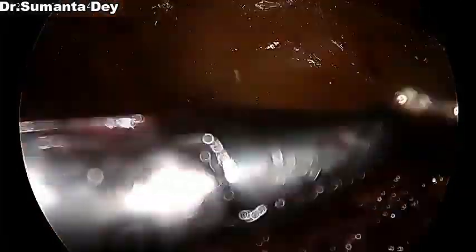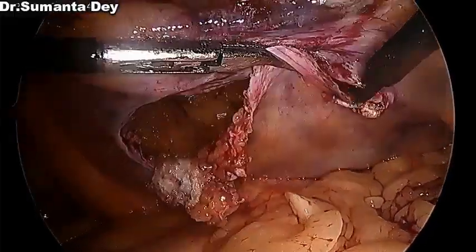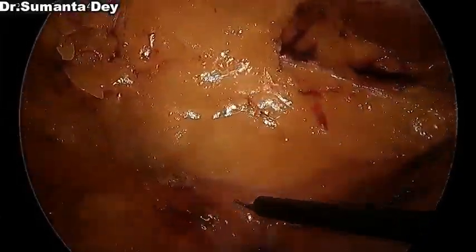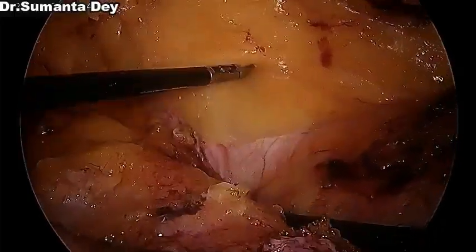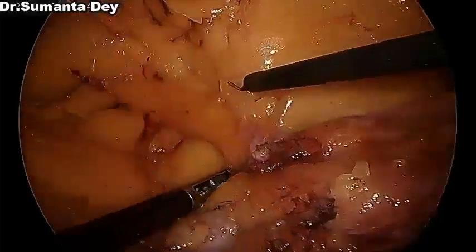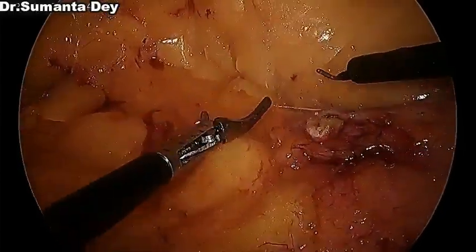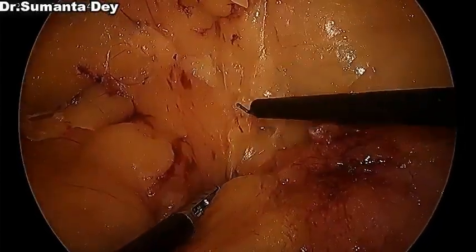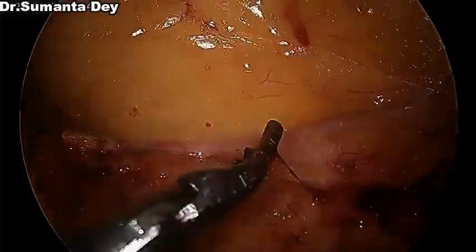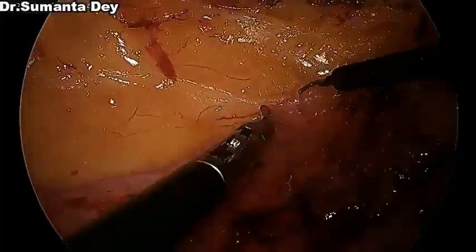So what you can do is, because the peritoneum is loose on the lateral side, after a certain amount of mobilization, you have to assess whether you can close the defect and close the peritoneal flap freely without any tension. If you find a little more mobilization is required, you can do it, because the peritoneum is loose here. So a good amount of traction with the left hand and counter traction can buy you more peritoneum from the groin. That will help you ultimately in closing the peritoneal flap and also the peritoneal rent.